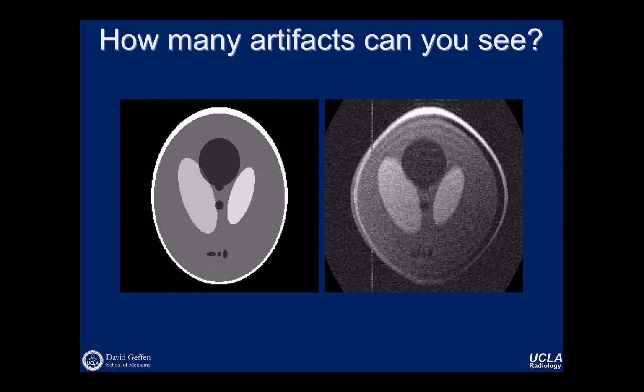Noise is an artifact, right? We don't want noise, and clearly the whole image has noise. So we don't always think of it as an artifact for some reason, right? But it's undesirable. An undesirable image feature is an artifact. Yep. So good pickup. So what you're identifying is this really bright ring on the outside here doesn't have the same physical correspondence that we expect. It should just be immediately adjacent to sort of this underlying tissue. But that brightest ring is obviously shifted to the right. So that's a good pickup.